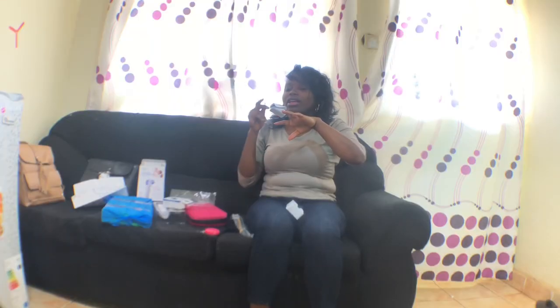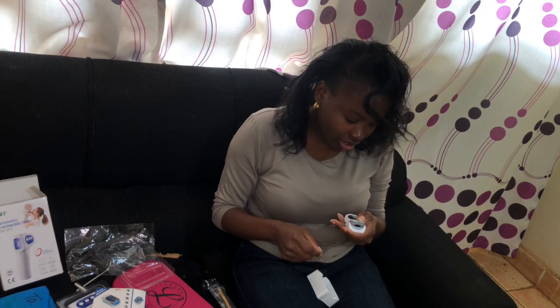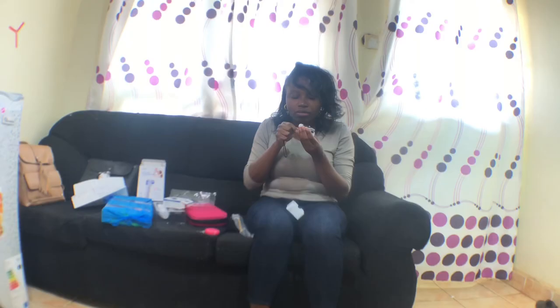Normal SpO2 is from 92 and above to 100. And for pulse rate, the average is 72, but normal is from 60 to 100. So I am good. Yeah, I guess I tried the finger. Oh, it's even telling you finger in, finger out. Okay. Awesome, I did it, guys.